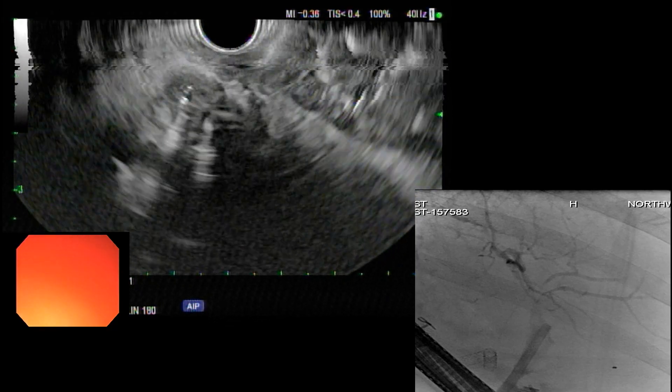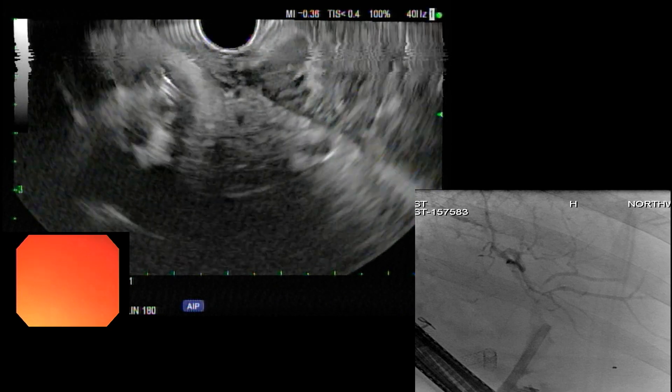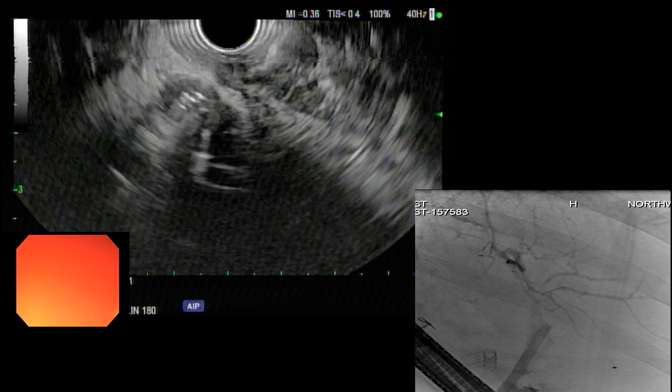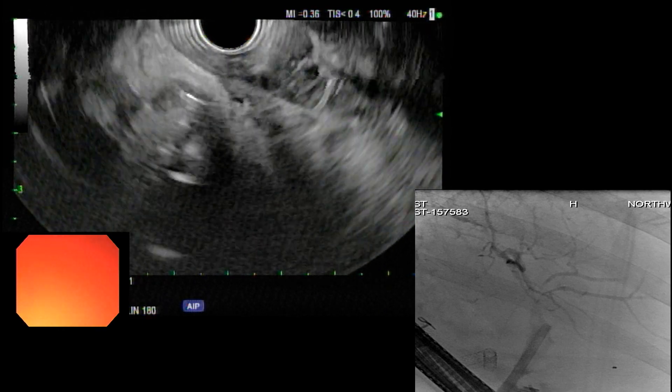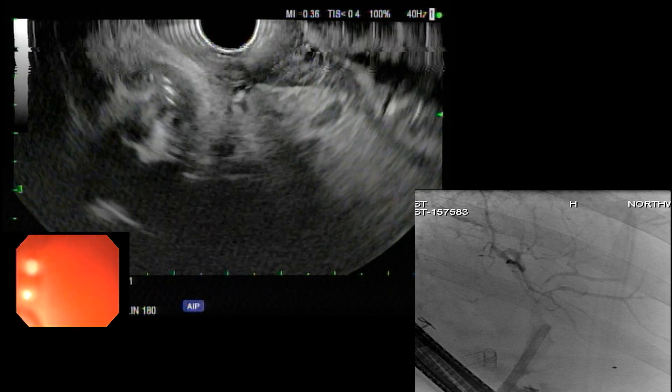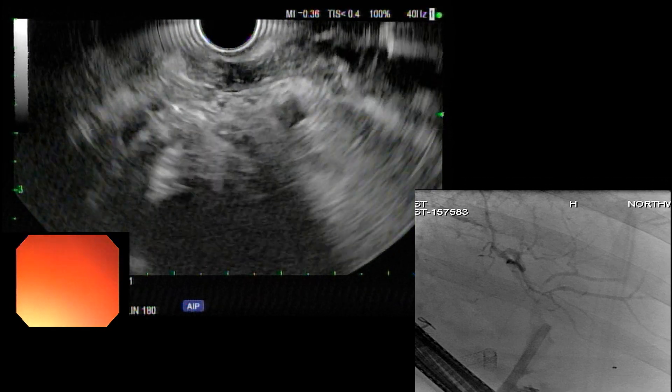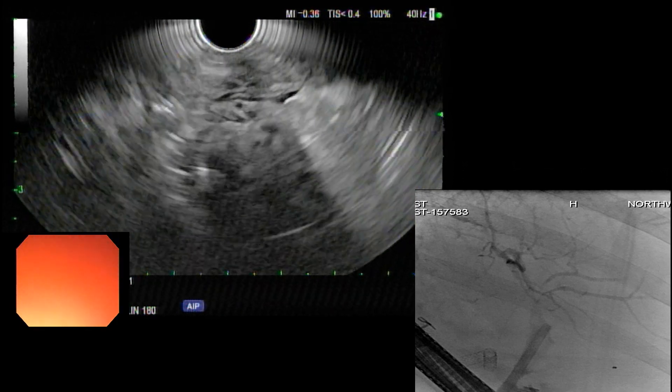So what you're seeing now — if you see in the center of my lumen, there's the area of the stricture. On the ultrasound, you can appreciate the stent going through; it's right in the middle there. There's biliary thickening. You just want to make sure there's no mass or anything concerning in this area — we don't see anything else. There's no significant lymphadenopathy.